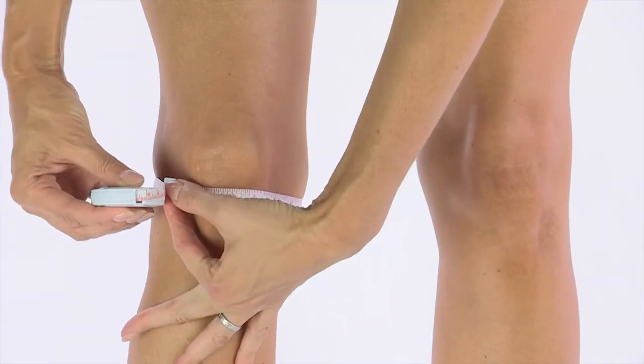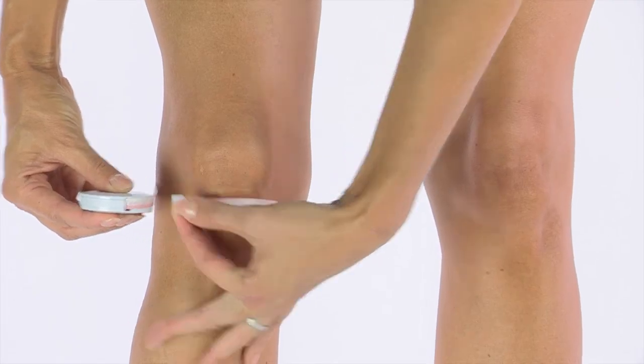First, measure the circumference of your leg at the midpoint of your kneecap.